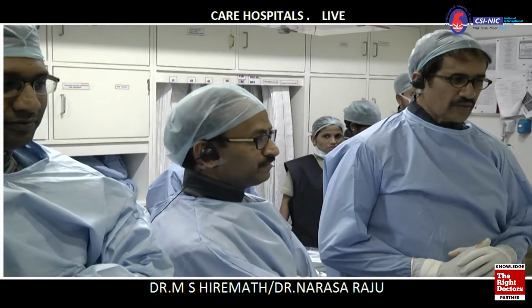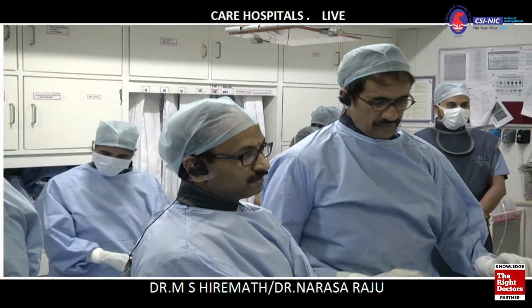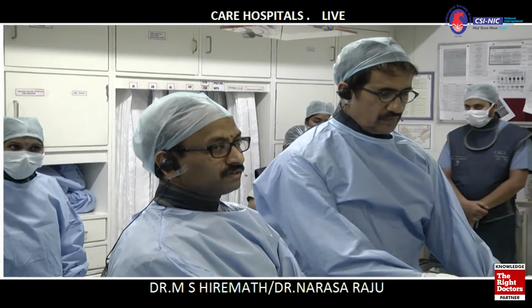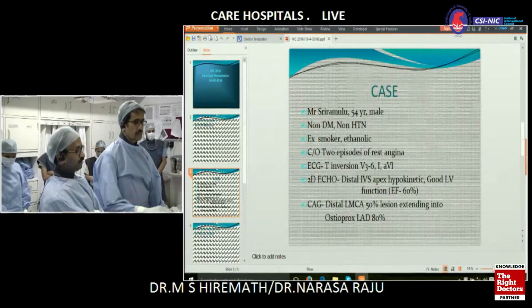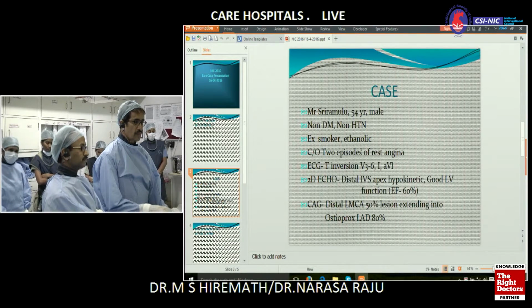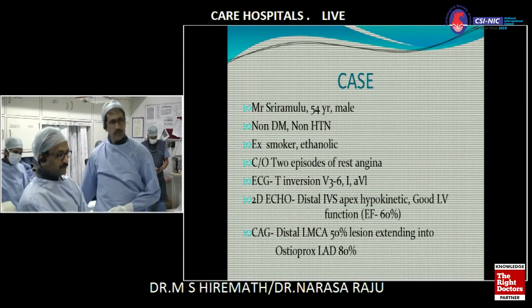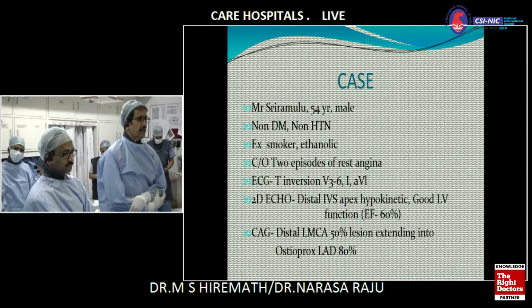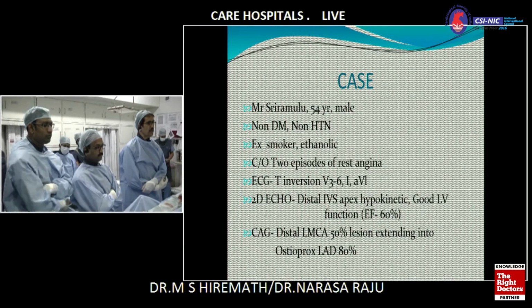Good afternoon, everybody. This is a 54-year-old gentleman with unstable angina and ECG changes in the anterior leads. His LV function is normal, enzymes are normal. So we did the angio, and we'll show you the angio directly. The right coronary is normal, dominant. Can we show the cine run?